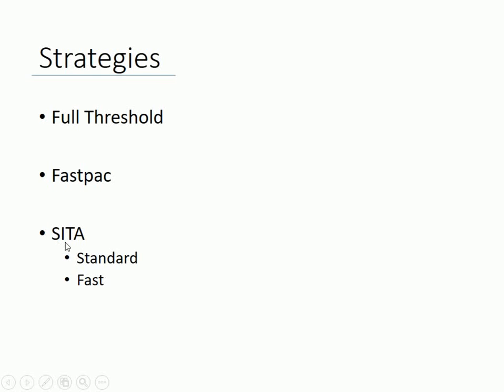SITA, by the way, stands for Swedish Interactive Thresholding Algorithm, and that refers to the group that came up with this particular algorithm. And then after this was used, because this was still, for some patients, a very difficult test to undergo in terms of the time that was required, they developed a more efficient algorithm, or at least one better in terms of the time it needed to take, that was shorter by about 2/3, called the SITA-FAST algorithm, with somewhat of a compromise in terms of the accuracy.